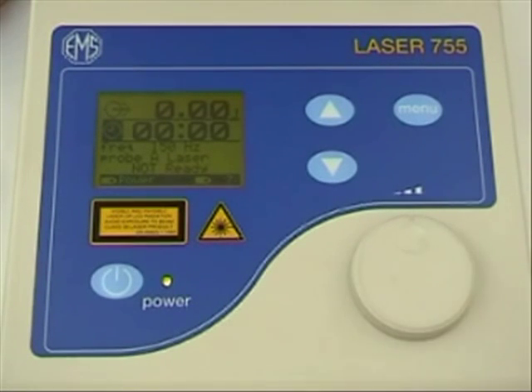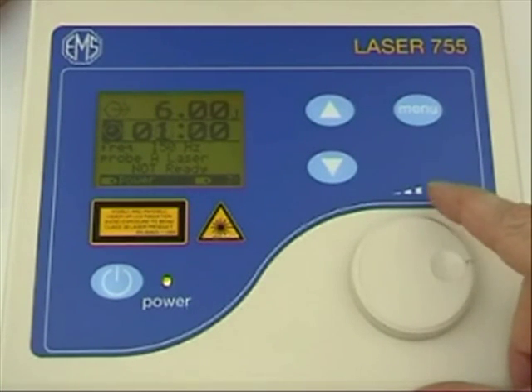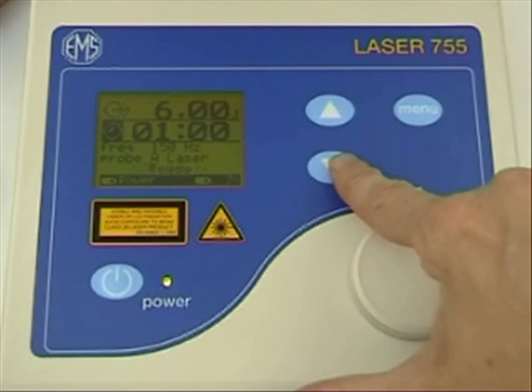There are two output sockets for ease of switching between probes, and the Laser 755 is mains and battery powered as standard.